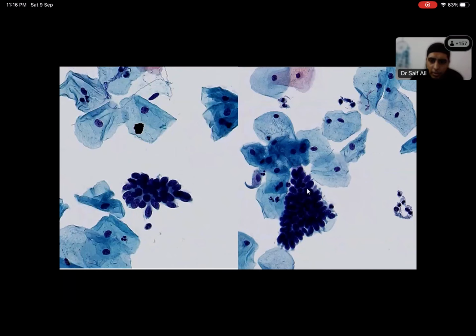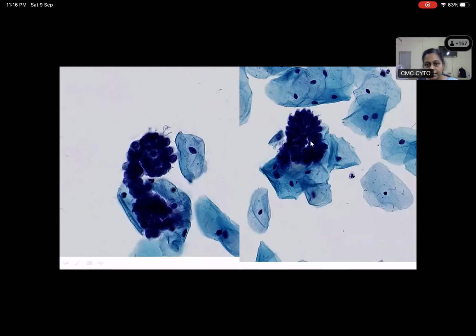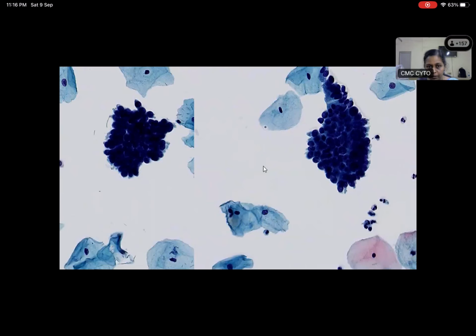Yeah. So what is that feathering? That is what you are seeing here, right? You're seeing some feathering in these clusters. Again, you can see that there is feathering in these clusters. And here you can see that it's actually forming something like a rosette pattern with severe crowding. Again, these clusters are also showing you.